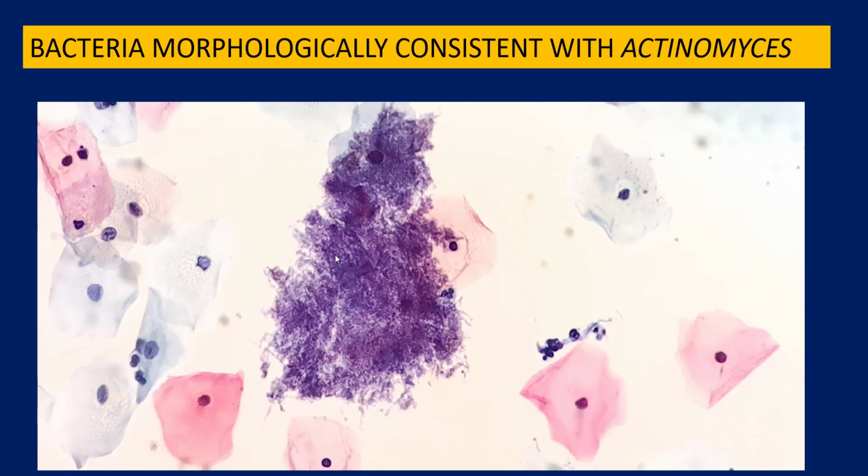Next in line are bacteria morphologically consistent with Actinomyces. These are identified by the presence of this pretty striking woolen ball or dust bunny kind of appearance, which is shown by the presence of these filamentous structures towards the edges.